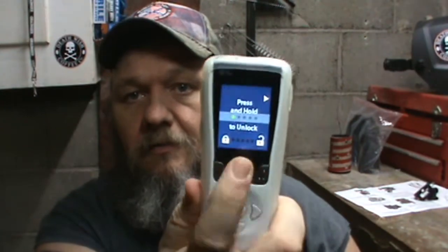I'll just come in here, hit the orange button, shut my stimulation off completely, and turn this on, go ahead and charge myself. Now, people who have to have this stimulator on 24 hours a day, 7 days a week, may not like the option of turning it off. And you don't have to turn this off to charge it. It will charge quicker if you turn it off, but you really don't have to. And trust me, I understand not wanting to turn it off. Really, I truly do. The option's yours. But once you start charging, this remote control is no longer an option.